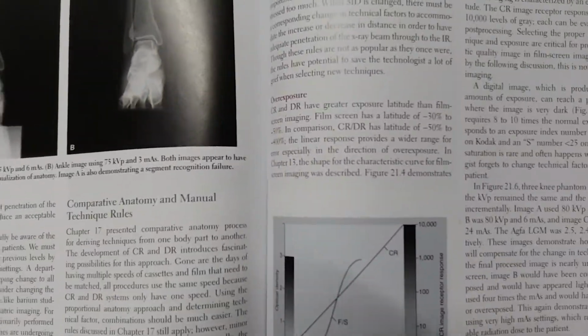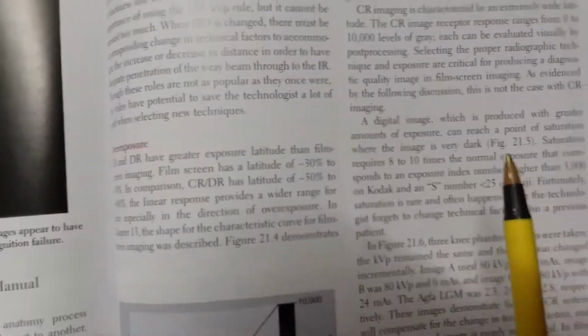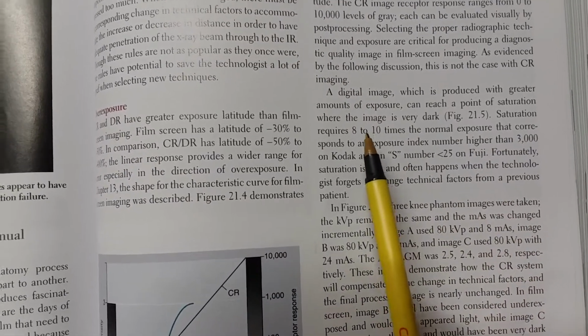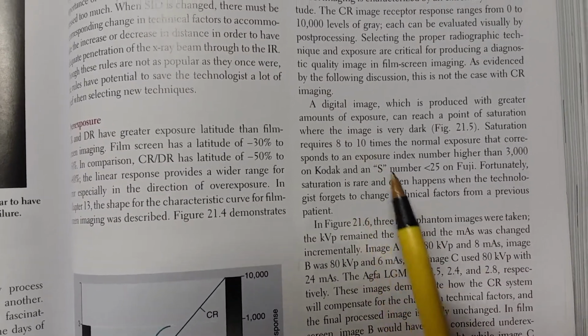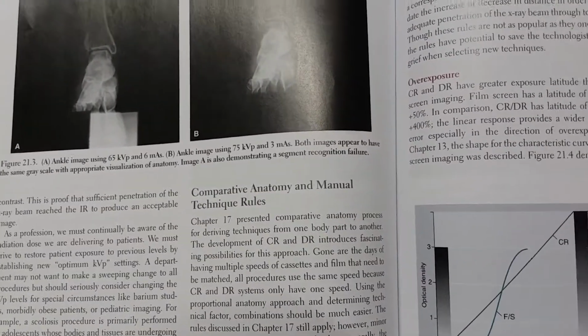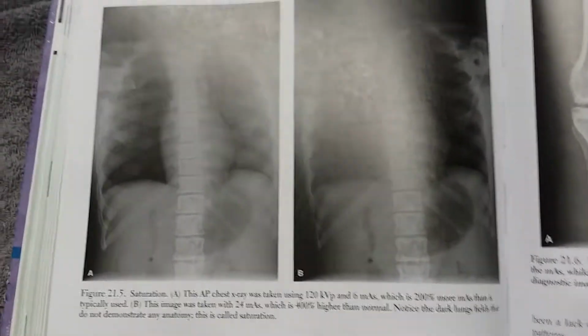All right, on page, let's see, 285, it also talks about the fact that saturation of the image will occur with 8 to 10 times the normal exposure level, but that's a lot. I mean, think about how many times greater than normal that would be before you get the digital image to even be saturated. Saturated means way grossly overexposed.